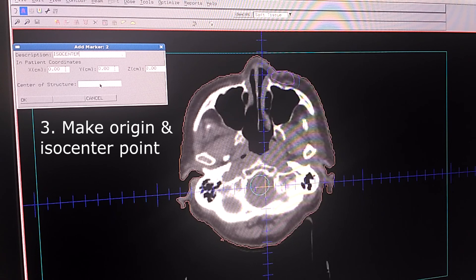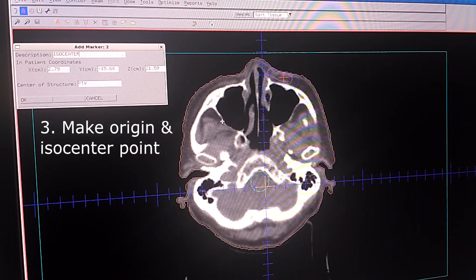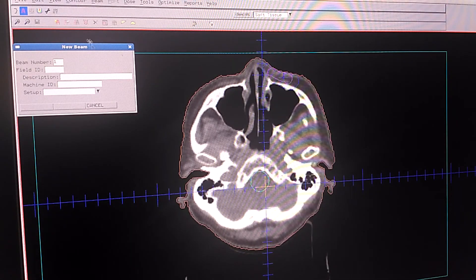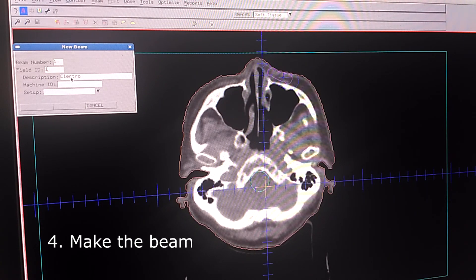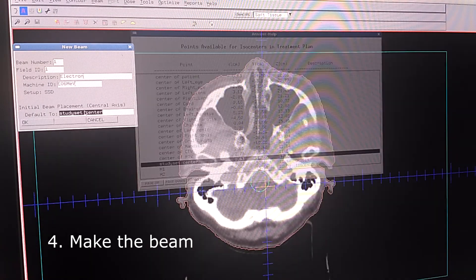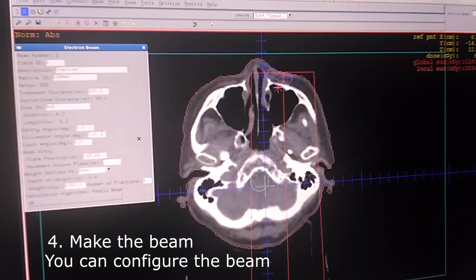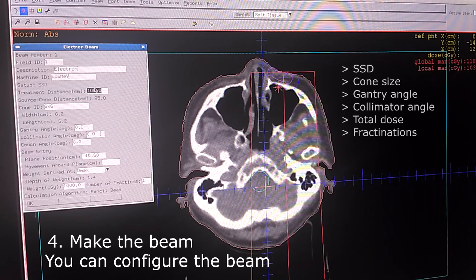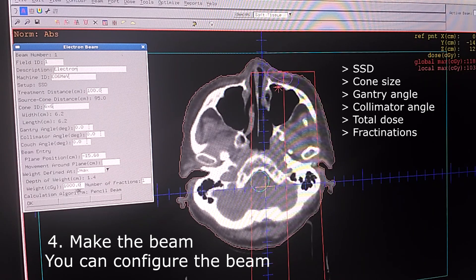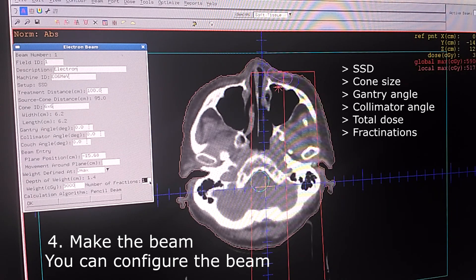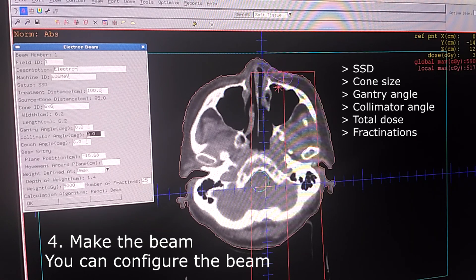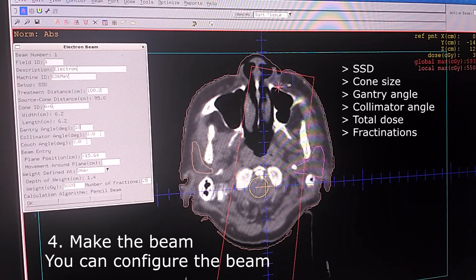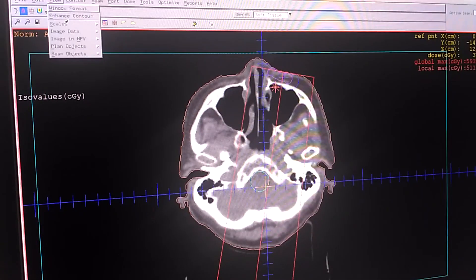Click OK and we make the beam. For example I'm going to name it into electron using 6 MeV electron and the initial beam placement using ISO center we just made. Click OK. And in the configuration we can change the SSD, the applicator, the gantry angle, the collimator angle, the dose and the fractions. For example I'm going to make a 50 gray case using 25 fractions using 6x6 applicator. Maybe I'm going to change the gantry angle into 10 degrees like that.